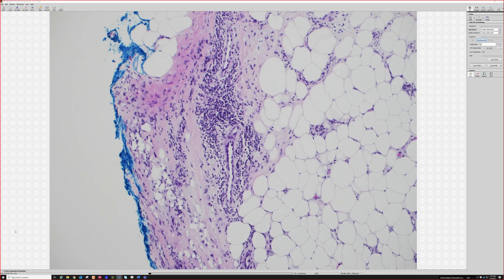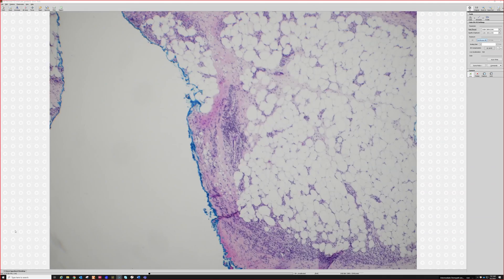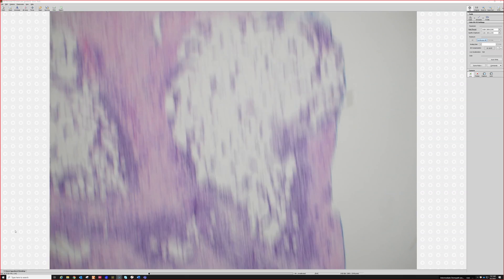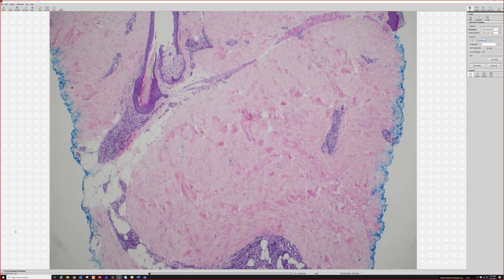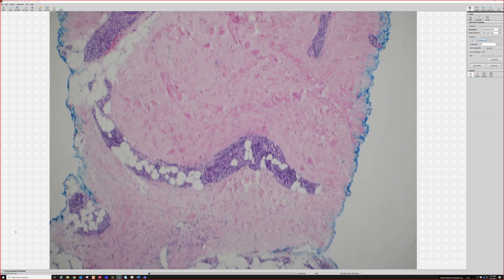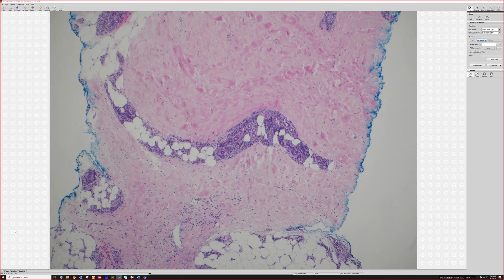That's a nice erythema nodosum — there were some giant cells. Really a good example and an awesome biopsy. Look at that — you can see a regular punch. If you just did one punch and only got down to here, I wouldn't be able to tell you anything on that.